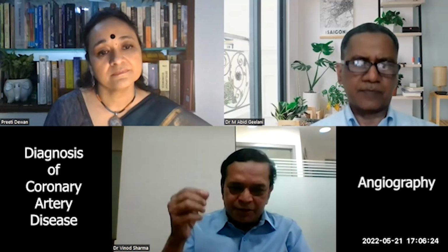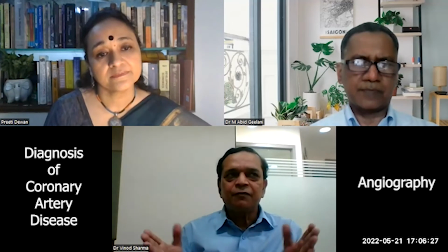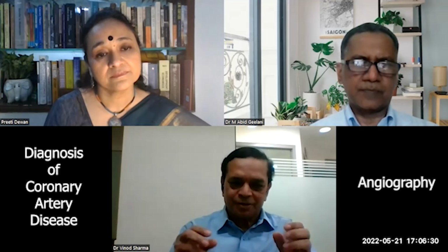Yes. So, sir, would you say that CT angiography gives as accurate a result in revealing CAD as the conventional angiography? If we compare the two, CT coronary angiography and conventional coronary angiography, truly CT angiography is more informative. In angiography, we are injecting the dye in the lumen of the artery. We are seeing just the lumen, and we are inferring the narrowing because the lumen is narrowed. We are not seeing the wall of the artery. Atherosclerotic disease is in the wall of the artery, not in the lumen. So by that criterion, CT coronary angiography is more informative.